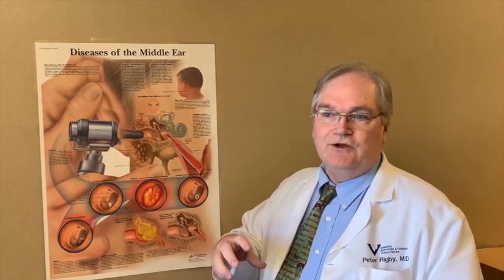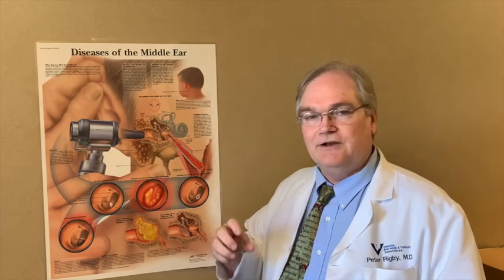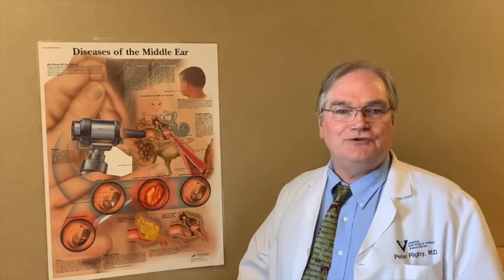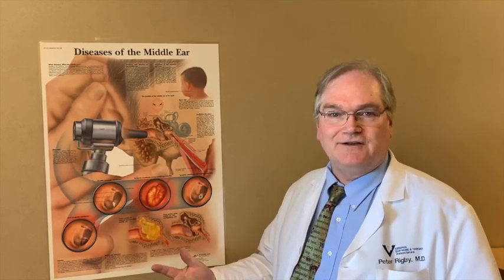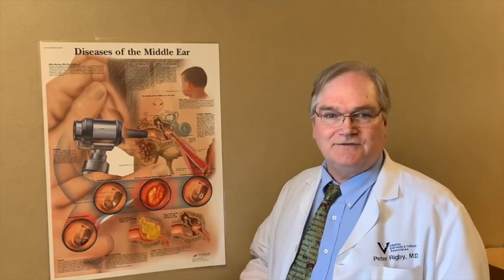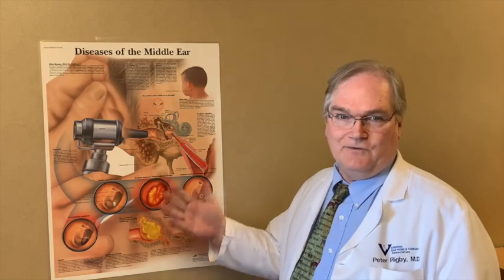As time goes on, those tubes will continue to move in the eardrum, actually along the eardrum. The eardrum grows from the center outward, and the tube will eventually get to the edge of the eardrum and then fall out. That time frame is usually about 6 months to a year. Once they fall out, then as long as there's not a recurrence of ear infections, that's all that needs to be done. Your doctor would look at those ears about every 6 months until both tubes have gone their way.